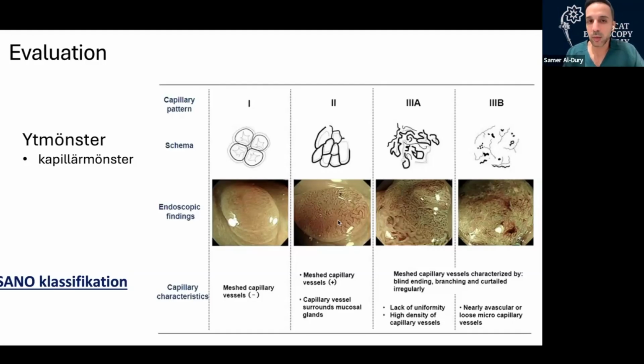and we always talk about them. So look at this compared to that, and this is why we think that this lesion contains maybe cancerous cells, or this is why it doesn't. I think that helps people get better at learning, basically teaching that muscle memory, right?